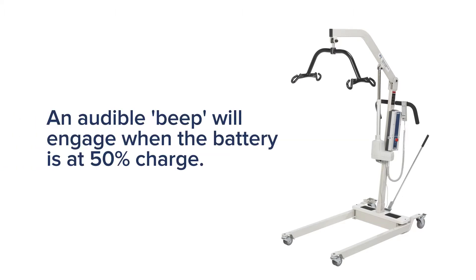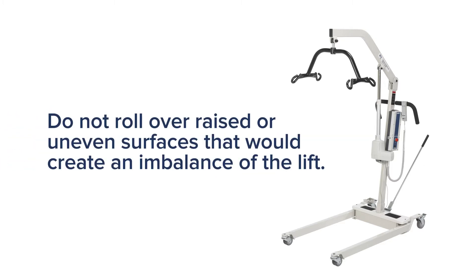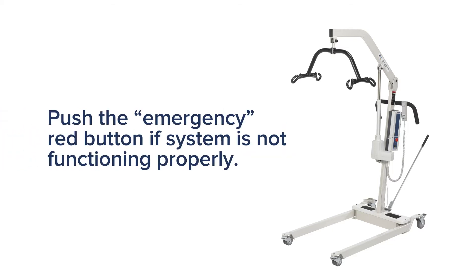When the battery power is below 50 percent, an audible beep will engage. When the warning is heard, charge the battery immediately. The patient lift cannot be lowered when the battery is not properly charged. With a patient suspended in the sling, do not roll the caster base over objects such as raised carpet bindings, door frames, or any uneven surfaces that would create an imbalance. Please use the steering handles at all times to maneuver the lift. Push the emergency red button if the control unit system is not functioning properly.